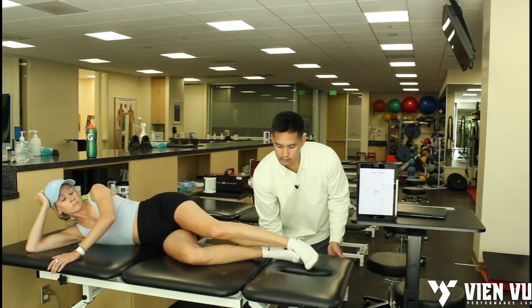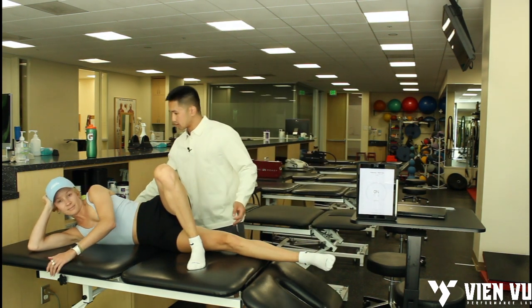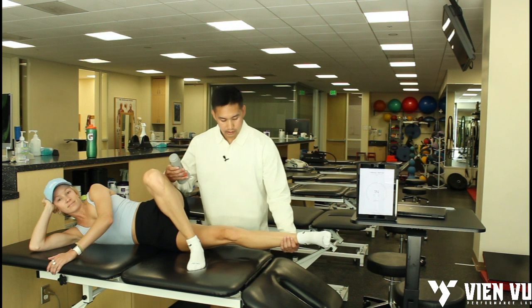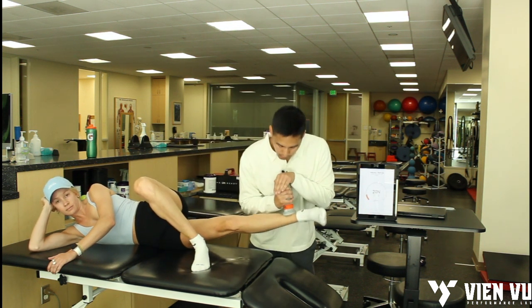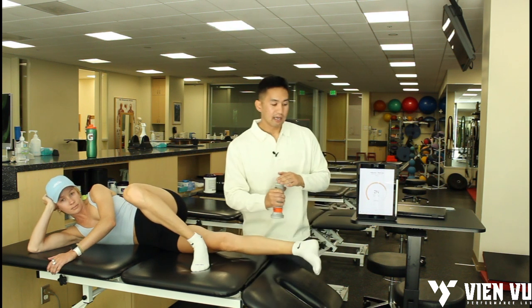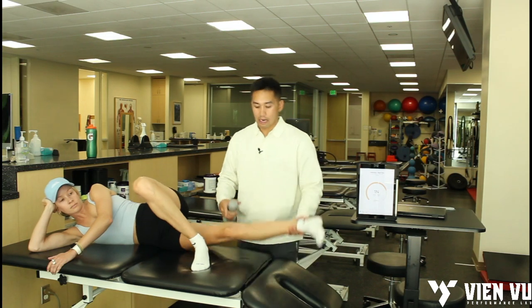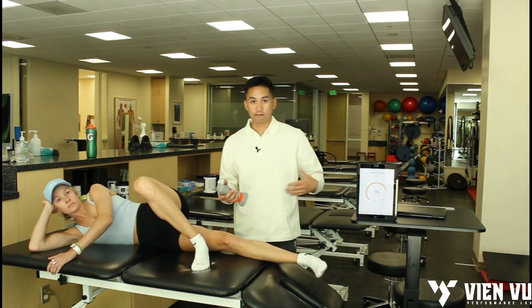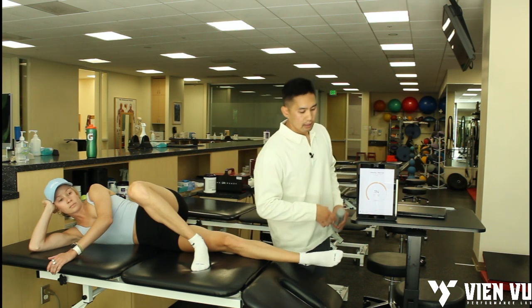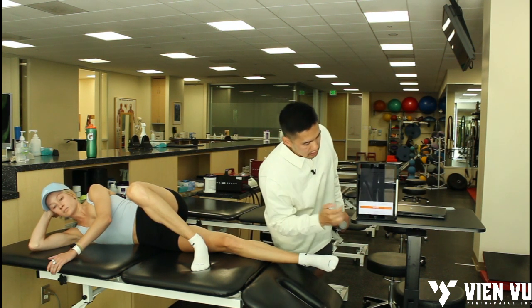It's like Stacy's already done this test — she knows what she's doing. Hold and go — hold, hold, hold and rest. I'm not going to push down as hard as I can; once it's at the table I'm going to give away right when I feel it break, because if we break down that's going to increase the force and give us a false value. That was the right side, so I'm going to have her turn over to the other side and hit Start Testing.